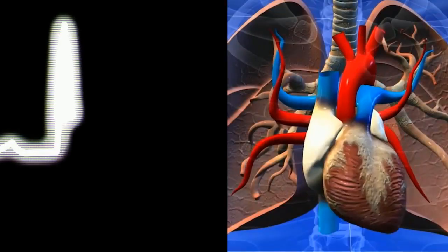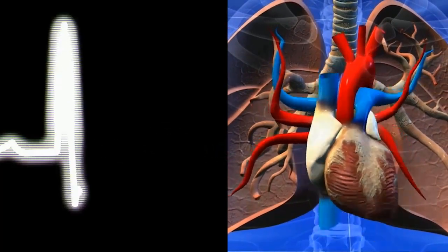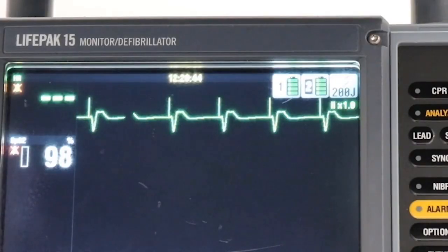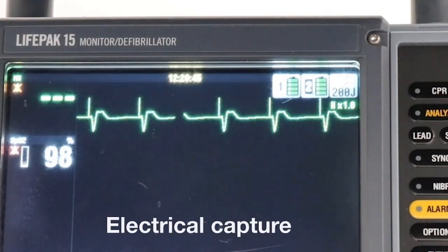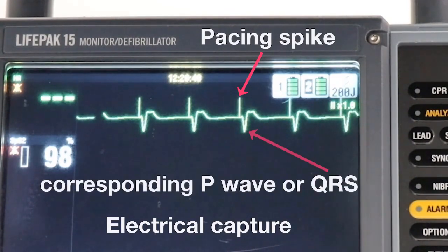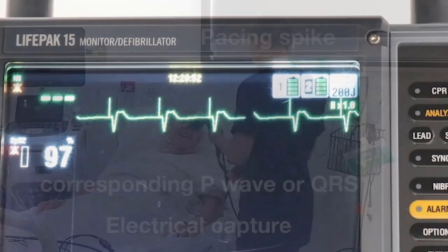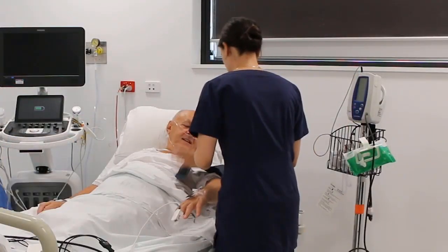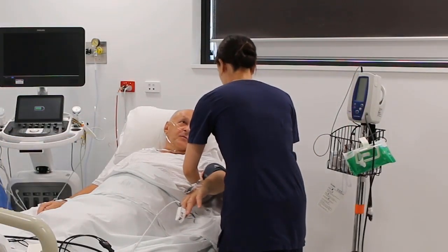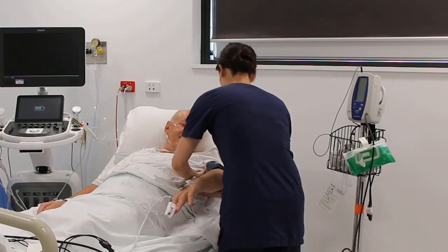Capture is both an electrical and a mechanical event. Electrical capture is indicated by a pacing spike followed by a corresponding p-wave or QRS complex. Mechanical capture is assessed by feeling for a pulse or checking blood pressure.